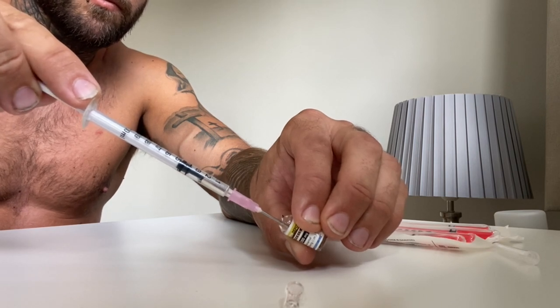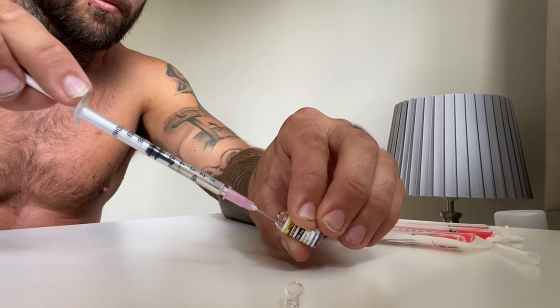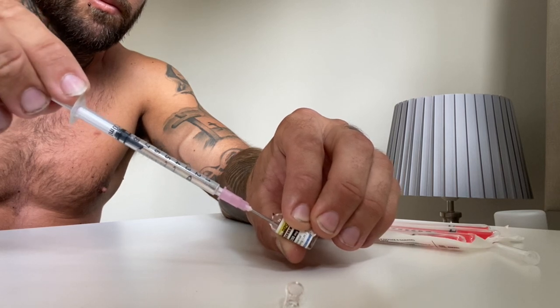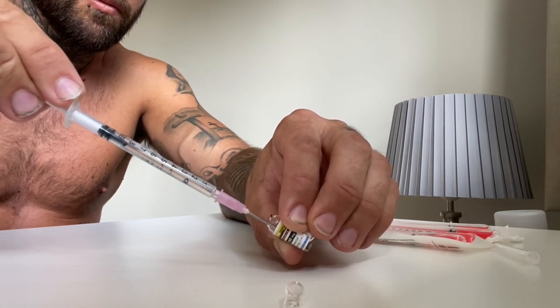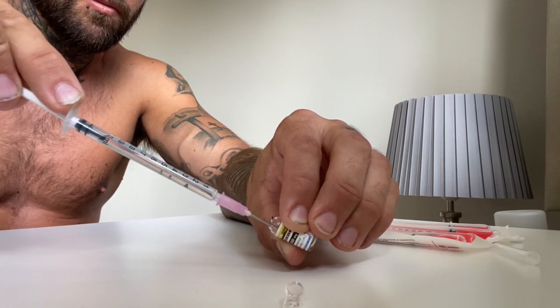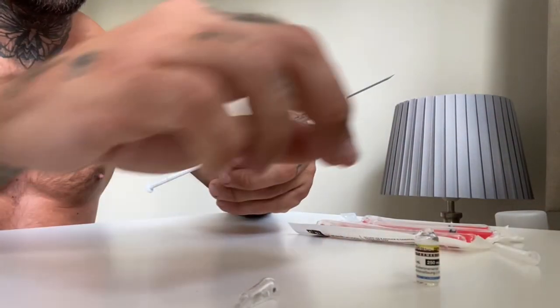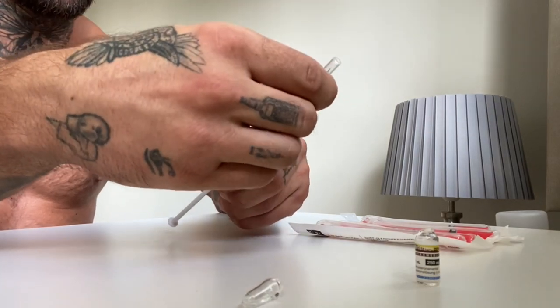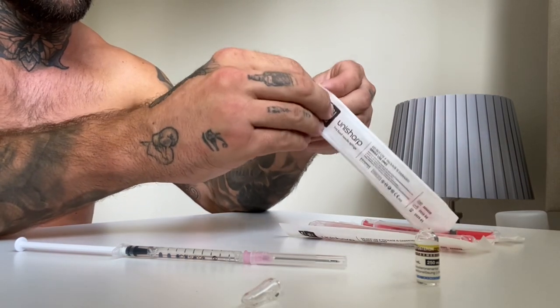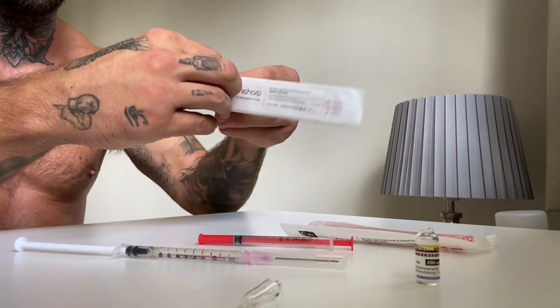You haven't got to rush, you've got to take your time — if you do rush you'll end up pulling air bubbles out. Any type of testosterone gets carried with oil so you have to be patient. The bigger the gauge the better; it's not like HCG where you're just pulling out water, this takes a bit of time. Sometimes people warm the oil up — years ago I used to put it in a warm bath or sink, because in winter the oil gets really thick. The hotter the oil, the more pliable it becomes. Now I've got my one mil of testosterone enanthate in my syringe ready to go.